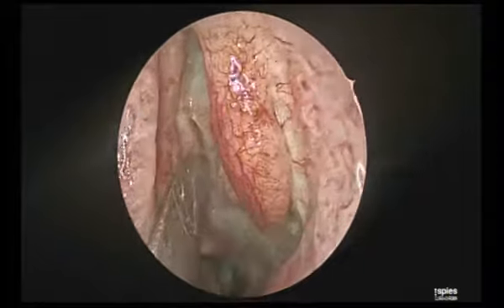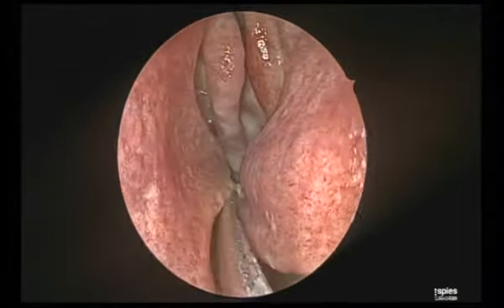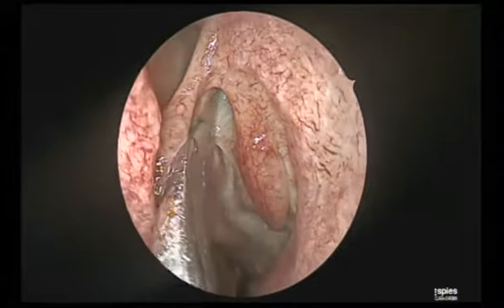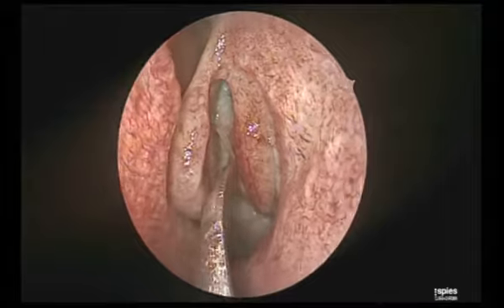Now, second thing, looking at the landmarks, you all know, there is no need to say what is the first part, second part, third part. So I am coming directly to the middle meatus. See now, this is the middle turbinate. What we all need in the middle meatus is to keep the middle turbinate medialized.